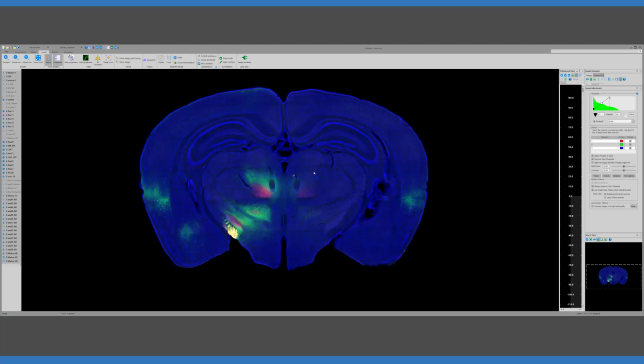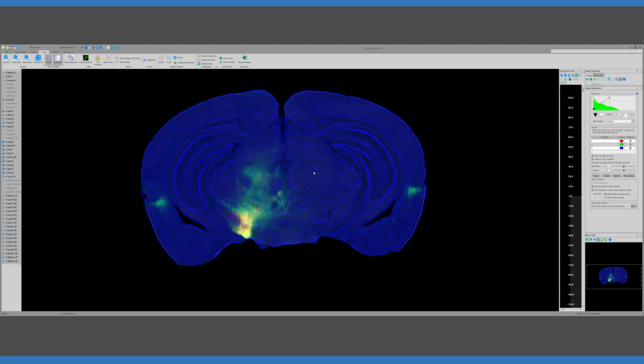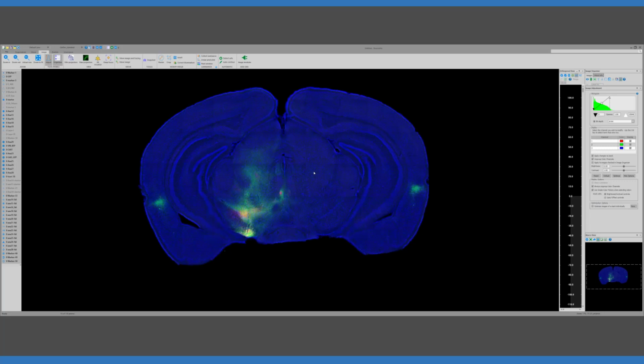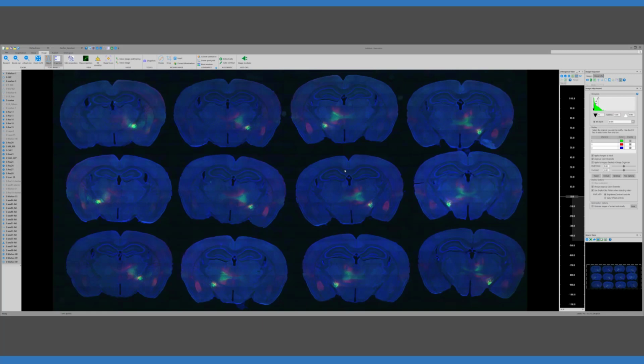And then what we showed in the last webinar was how to take this whole volume reconstruction and register that to the Allen space. What today I want to talk about is how we use the BrainMaker function to actually make this 3D volume. So this is a single slide of serial sections, and I took just slide number 4 from this particular brain through the thalamic areas. You can see the basolateral amygdala, the projections into the thalamus and all.